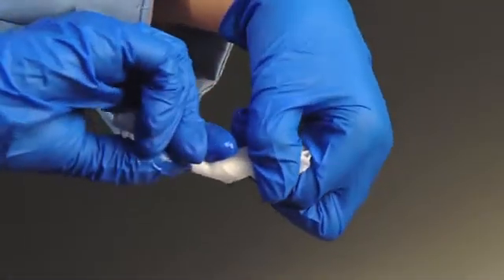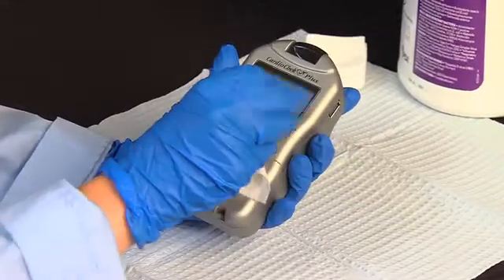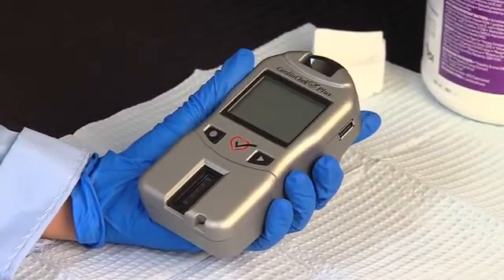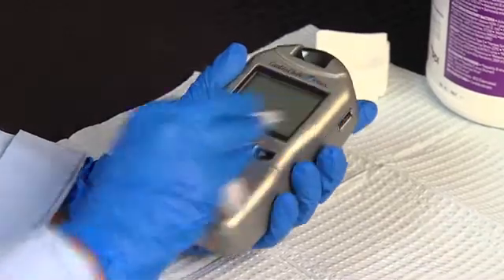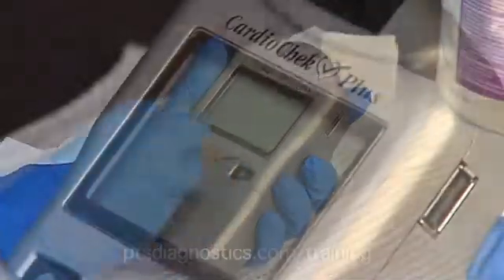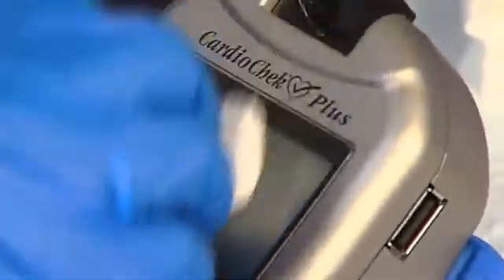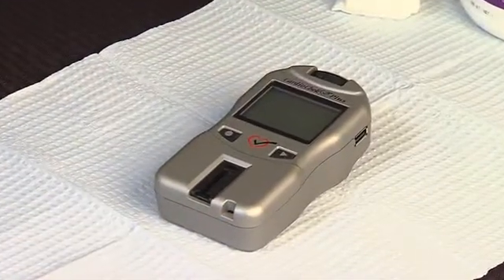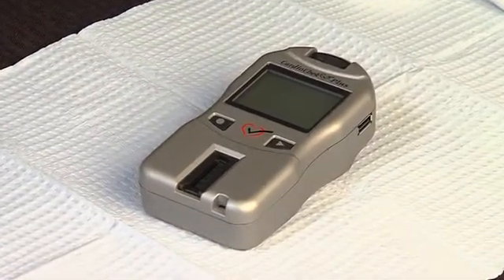First, wring out the excess liquid, then carefully wipe the analyzer clean. It's important to clean the analyzer thoroughly before disinfecting, so make sure to clean all surfaces well. Dispose of the wipe according to universal guidelines, then you can dry the analyzer with cotton gauze or allow it to air dry.